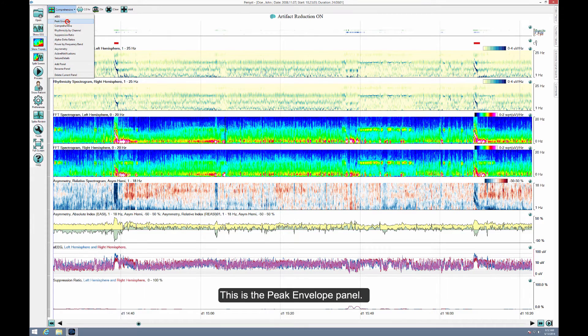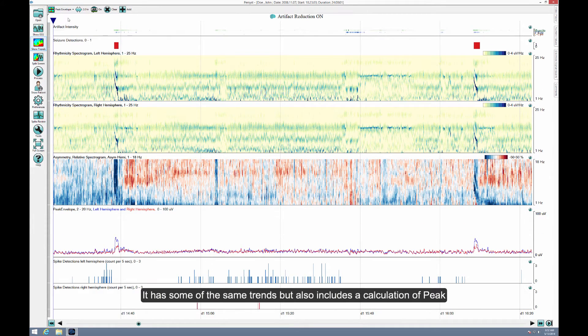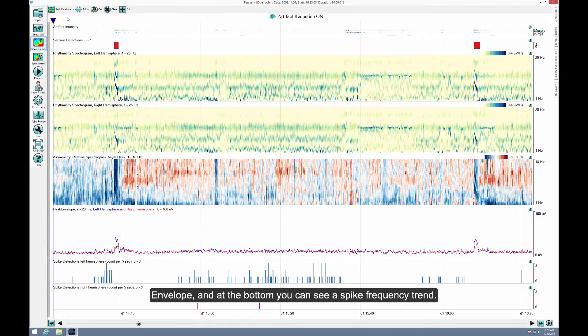This is the Peak Envelope panel. It has some of the same trends, but also includes a calculation of peak envelope. And at the bottom, you can see a spike frequency trend.